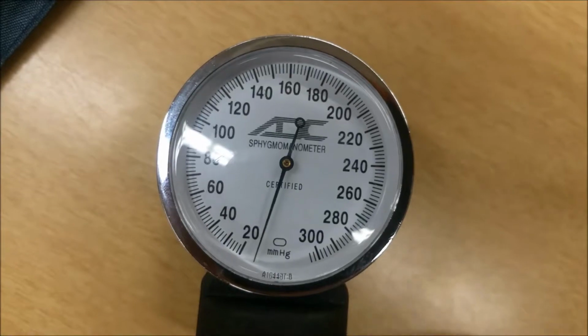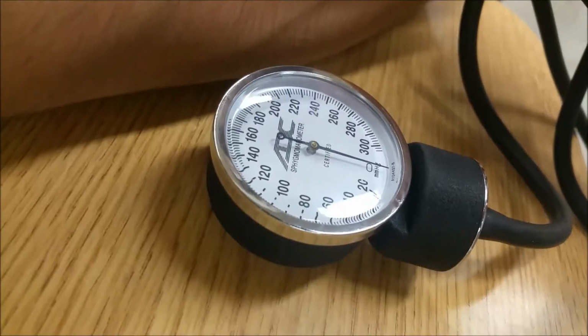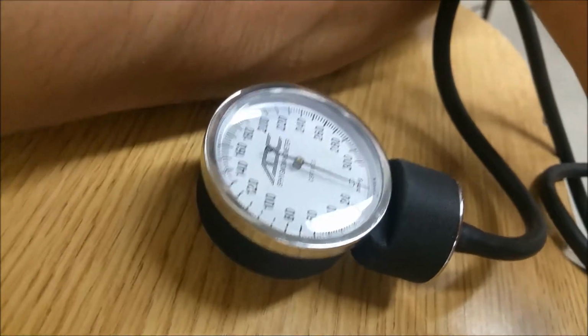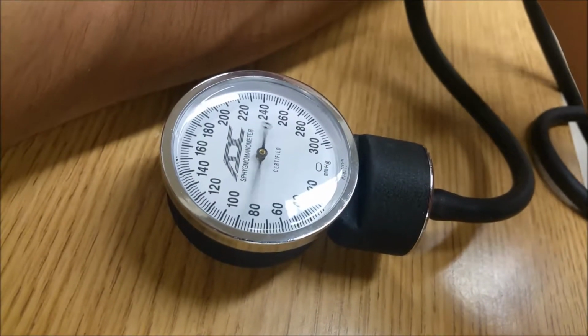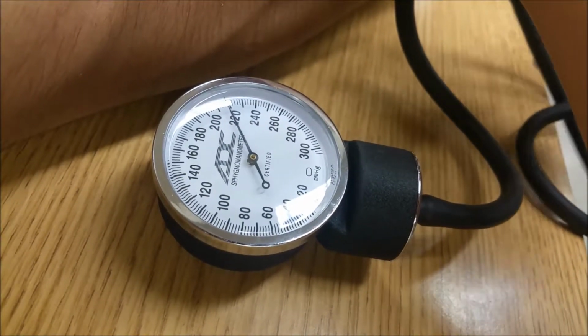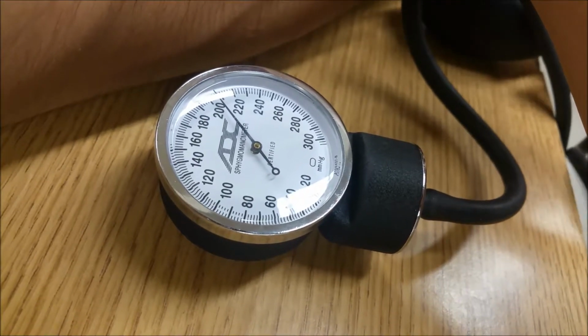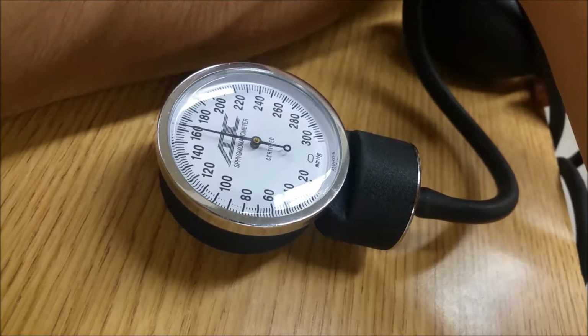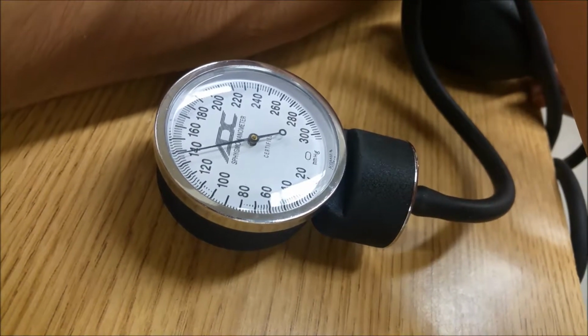Blood pressure is an important measurement which can assess the level of risk for cardiovascular events, and that should be taken prior to starting an exercise program. An individual's blood pressure should be determined from more than one measurement during 2 or more different occasions. To assess blood pressure, follow these procedures.